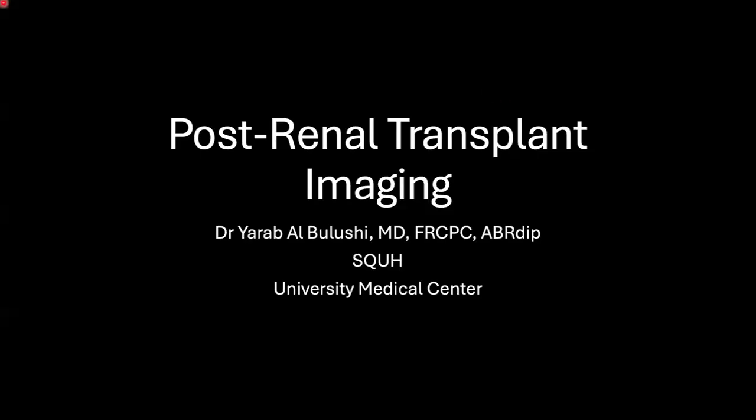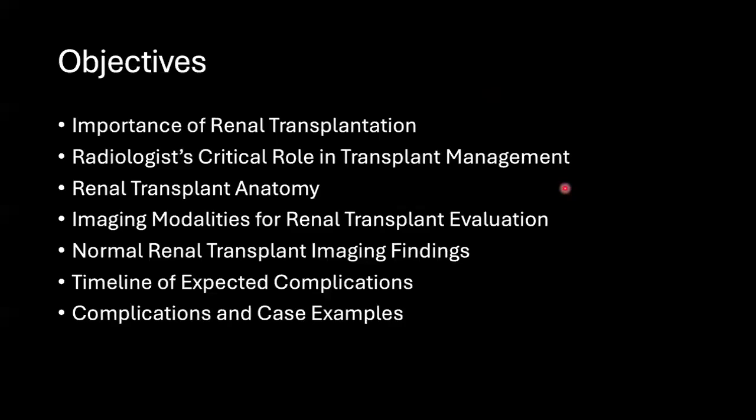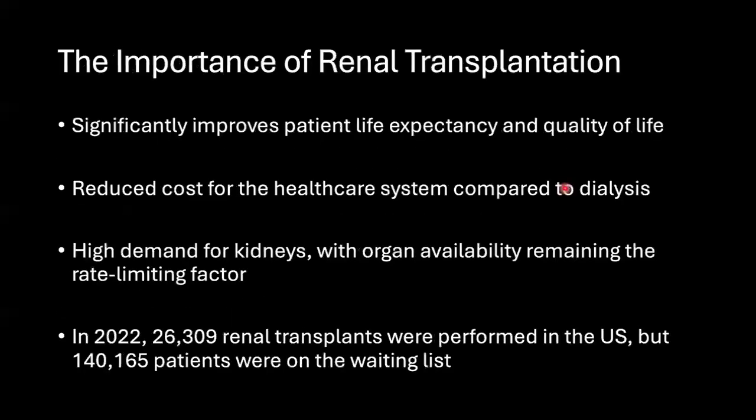If I were teaching radiologists or radiology residents, it would require hours, so we'll go briefly over the commonest findings. We're mainly focusing on post-transplant renal imaging, not pre-transplant workup. We'll go over the importance of renal transplantation, which of course you don't need to be preached about. And we'll go over the radiologist's role, renal transplant anatomy, the imaging modalities, and then normal imaging findings along with complications, which are very important to you.